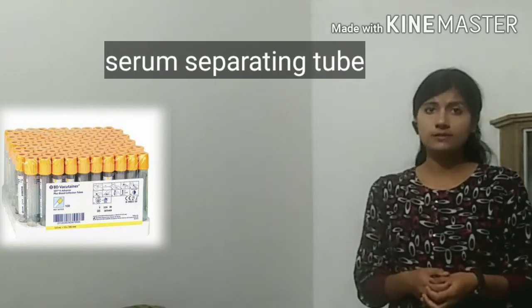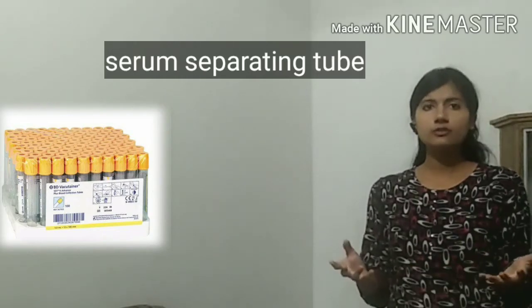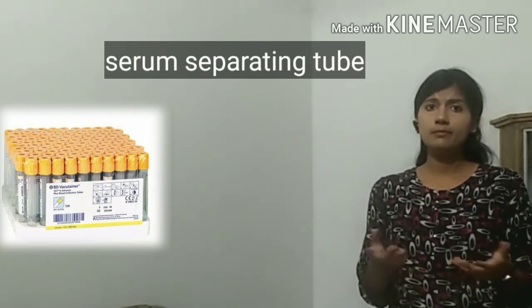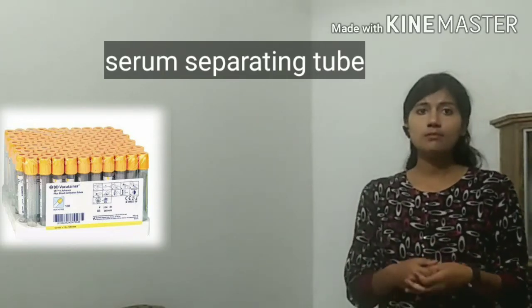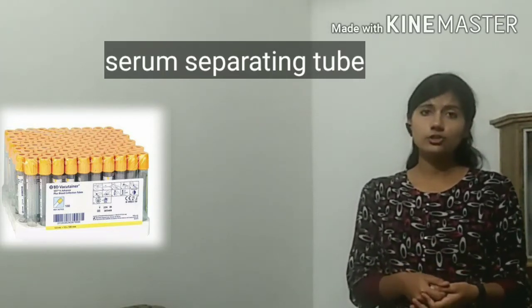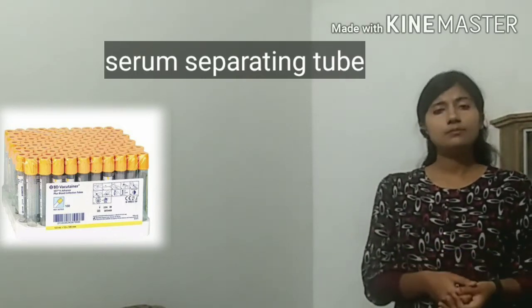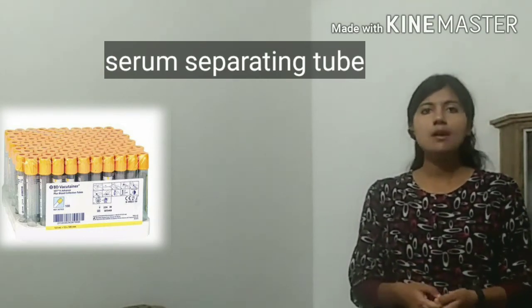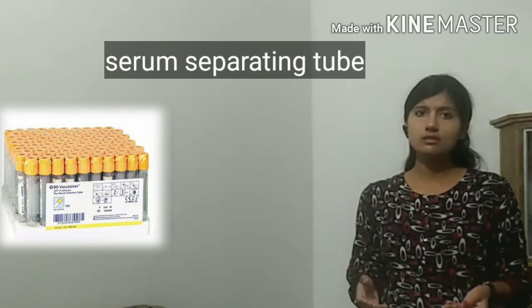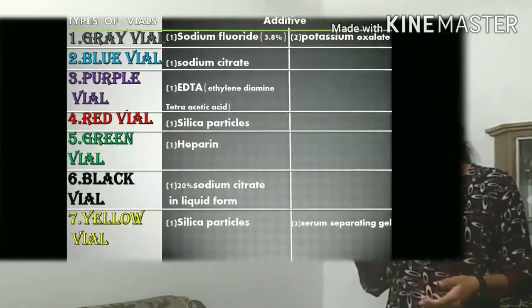It contains two additives. First, silica particles and second, serum separating gel. Uses of yellow vial. It is used for biochemistry tests, immunology tests, endocrinology tests, oncology tests, microbiology assay tests, toxicology assay tests, bone profile tests, lipid profile tests, tumor markers, drug level tests, for example, paracetamol, salicylates, digoxin, lithium, gentamicins levels can be tested. Now take a look at the snapshot of what we learned in this video.